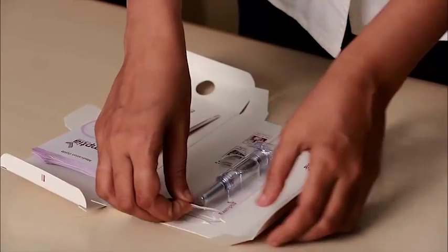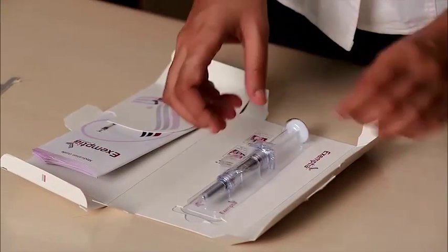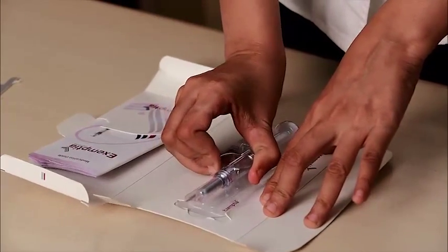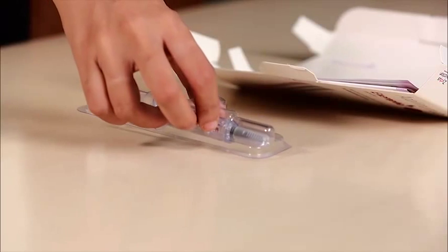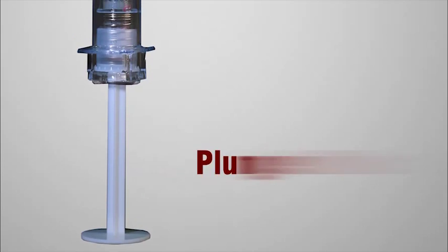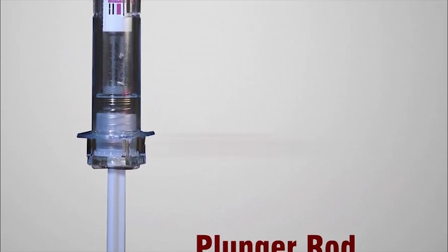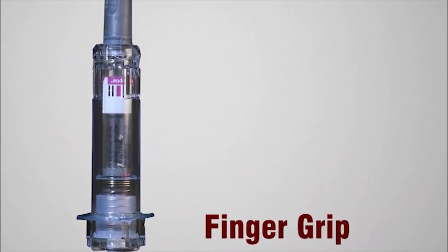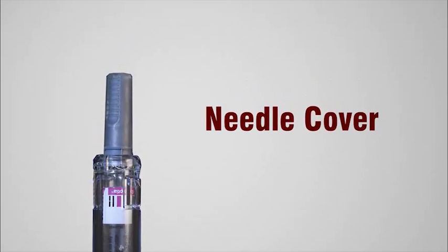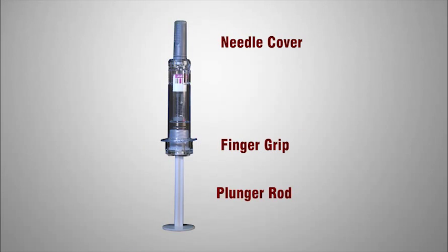To remove the PFS, tear the flap like this. Remove the PFS and place it on a clean surface along with the following material. The PFS consists of the plunger rod on top, an aesthetically designed finger grip for comfortable use, and a needle cover for hygiene and safety.